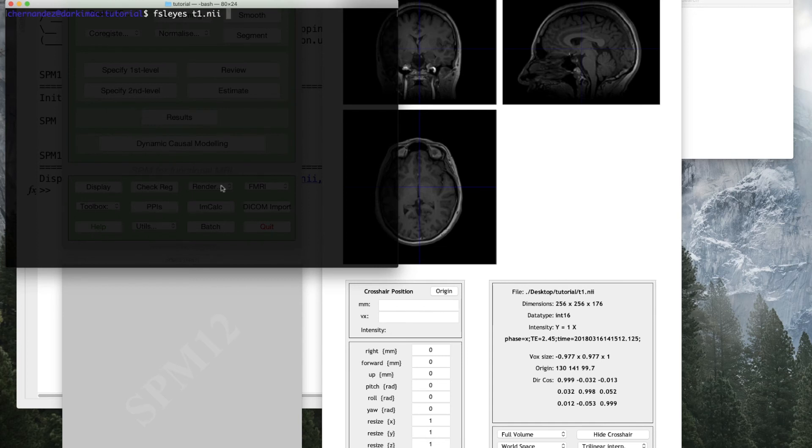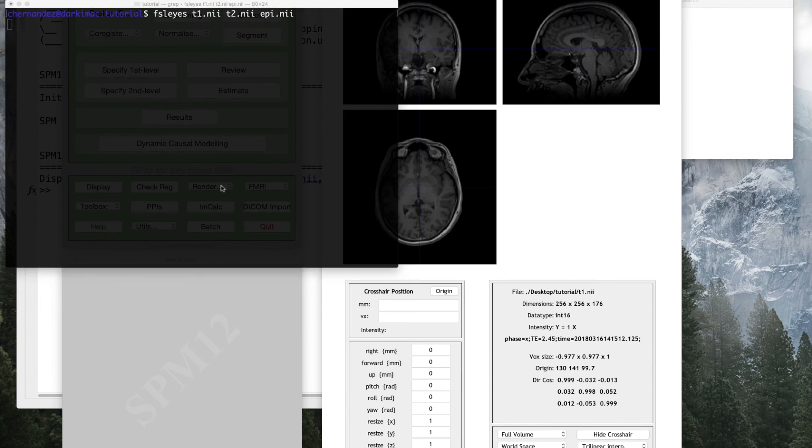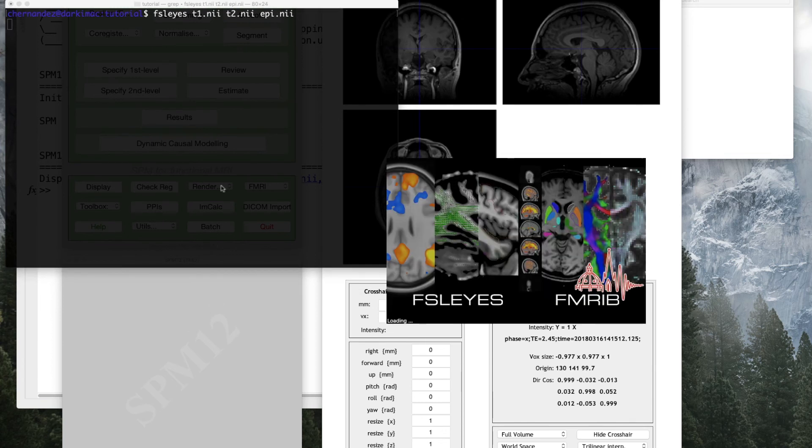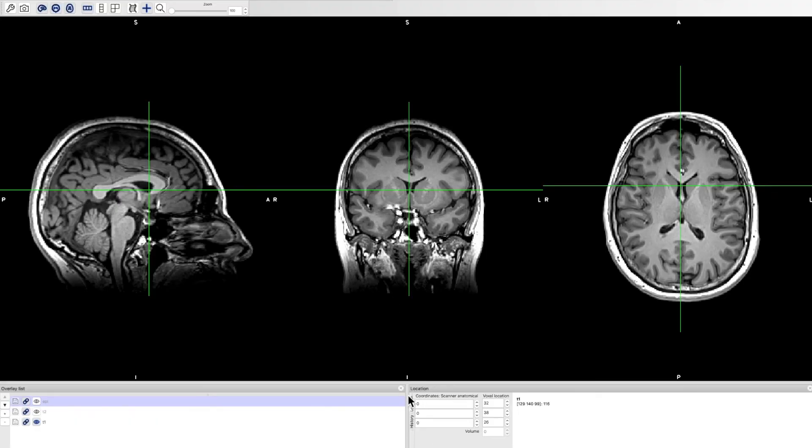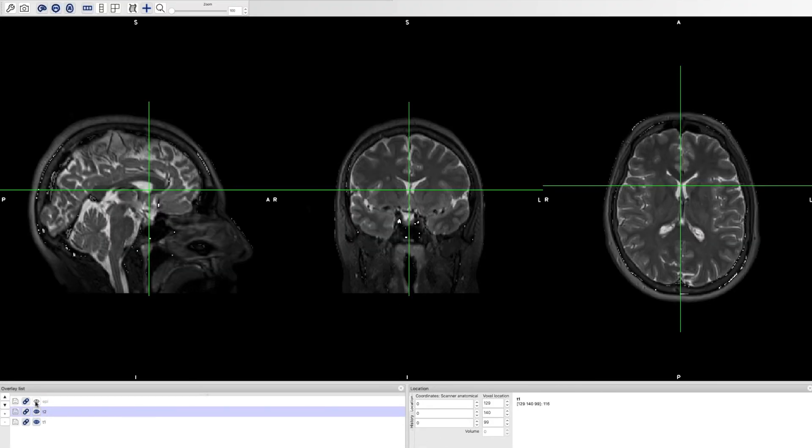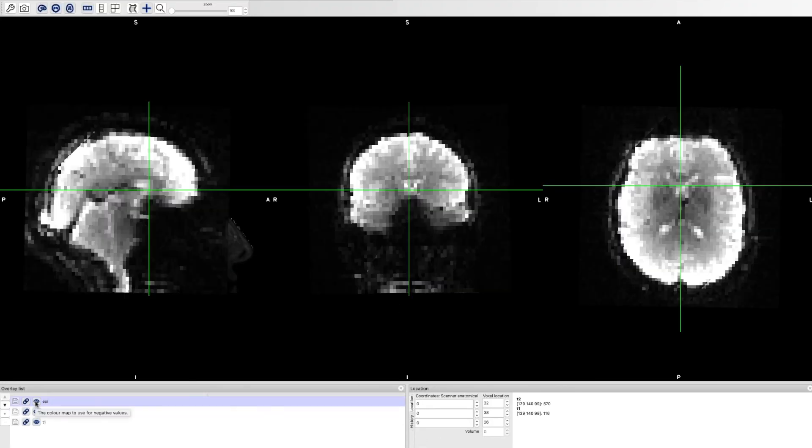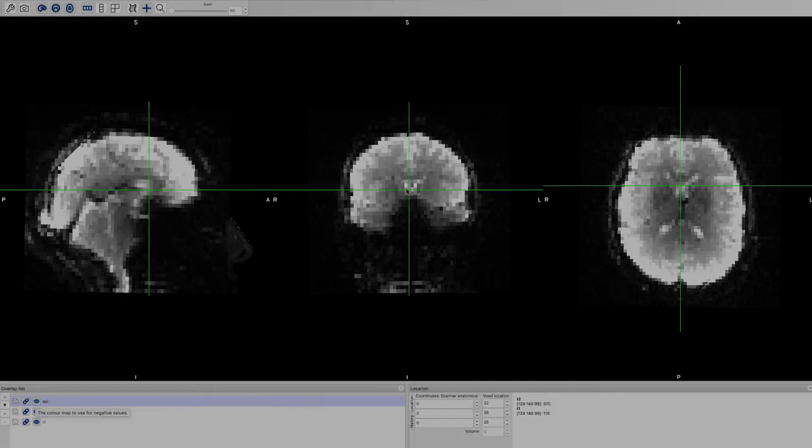For this example, I will use a T1, a T2, and a functional image of one single subject. Before using Soot, I aligned all of them, therefore I can apply any deformation to any of the images.